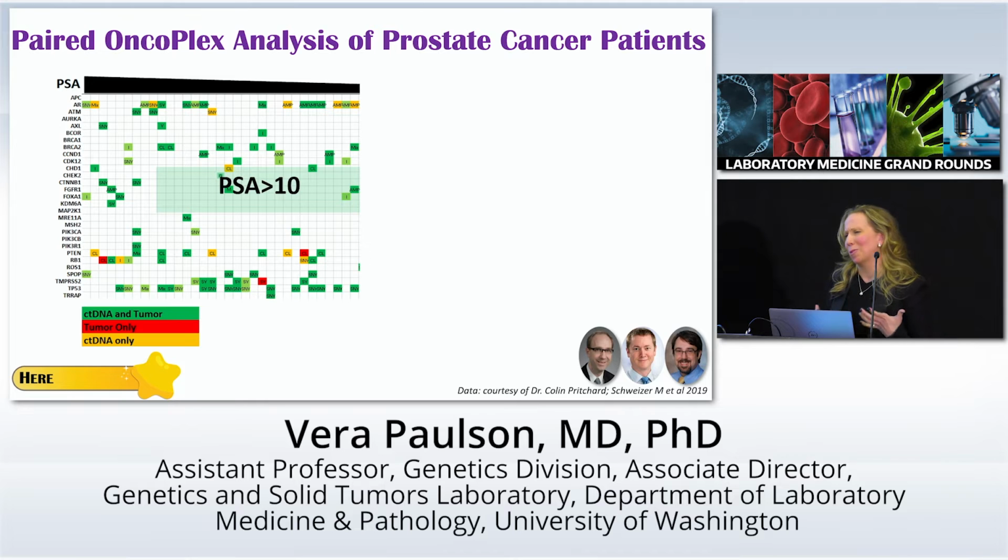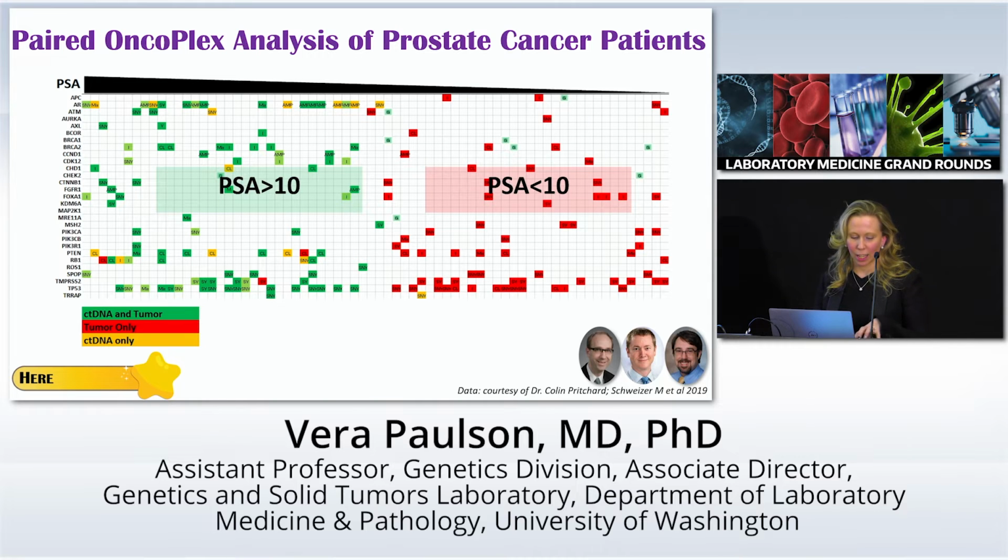One of the things, maybe you know why I highlighted prostate cancer. I have to thank Dr. Pritchard for his slides that he was kind enough to share. We have a lot of data here in this sphere, and really what makes it unique is that we're not just testing circulating tumor DNA. For everyone that there's matched FFPE, we're testing that as well, and we're doing a whole blood control by comparison.